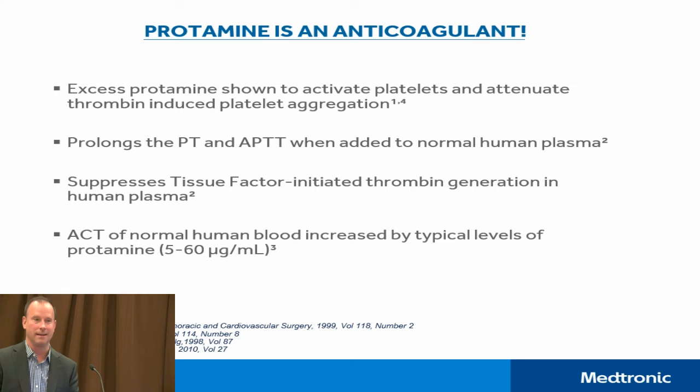Another case I was in where 500 milligrams was a standard protocol for everybody, and that's just what they're used to. And that was a function of this practice having to give so much more heparin because they couldn't get to target due to the less efficacious heparin that's around today. So their fix, rather than being specific, was just, we'll just give more heparin and we'll just give more protamine, and that'll cure it all. Well, it made for a host of new problems that they're dealing with now, and we're helping them get through it and get to a more specific mindset.